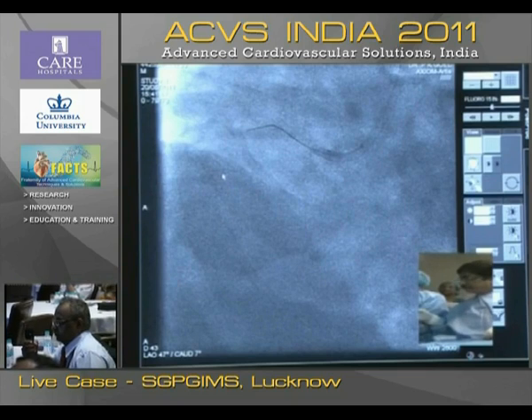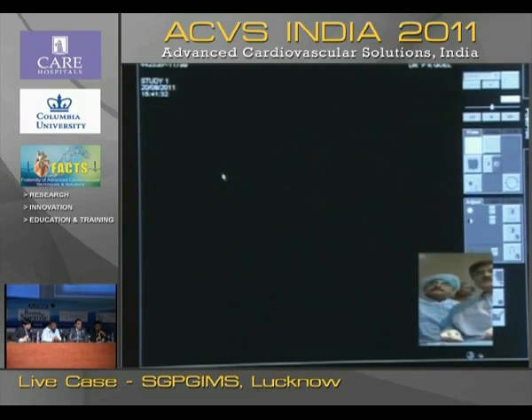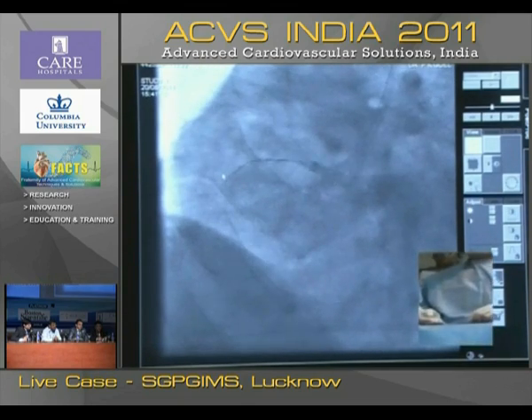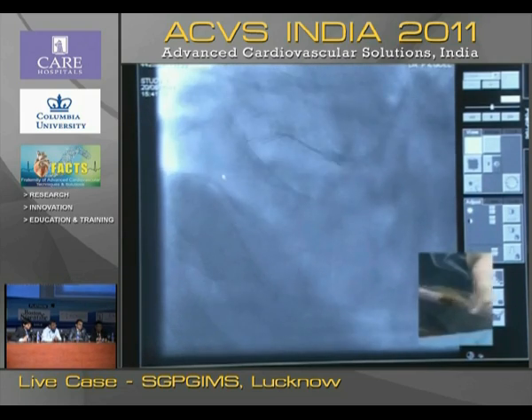Yeah, you have something to say. Yeah, there is a small nipple at the side of the lesion, but this is only going to be an explore the challenging case lesion, because the big collateral is very, very close. So sometimes the wire keeps on going there. What wire is this finally? Is it a whisper wire? Yes. No.